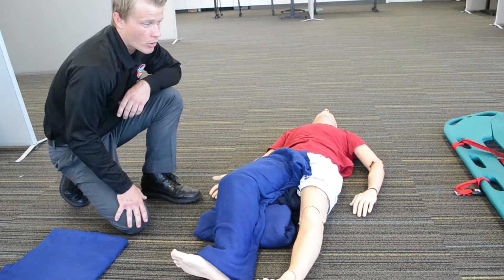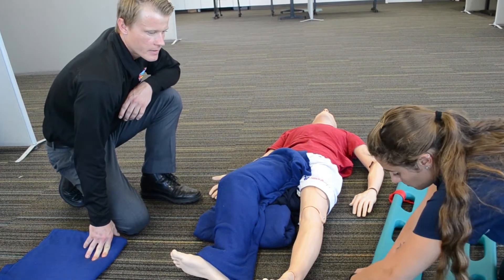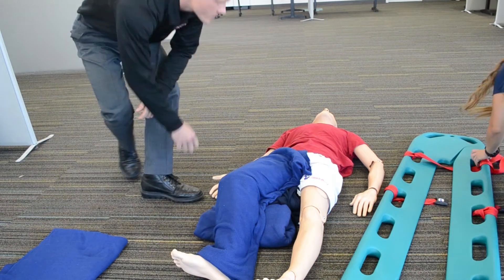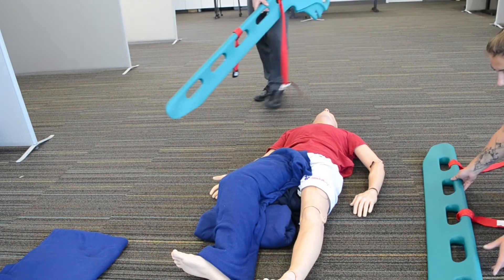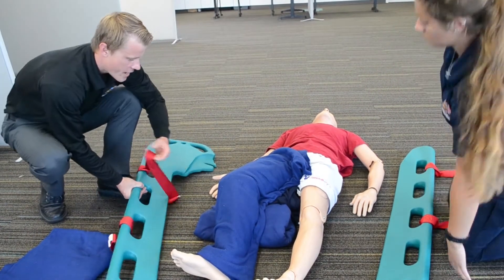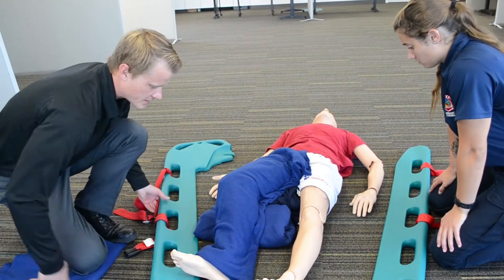I'm going to have my partner with a scoop stretcher disconnect that scoop stretcher. We'll split it in half — I'll take one half over here. Making sure that we don't pass anything over the patient. Also, if you have another person on scene, they could be applying an ice pack to that injury.